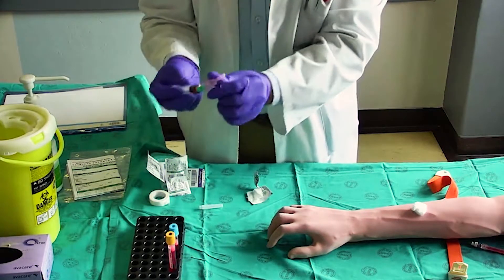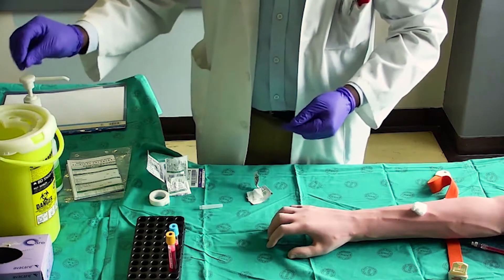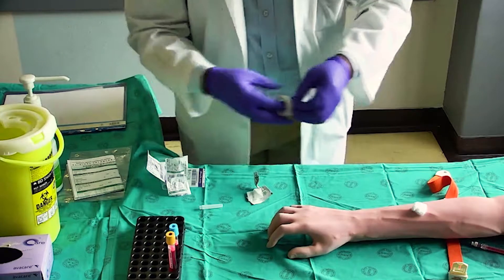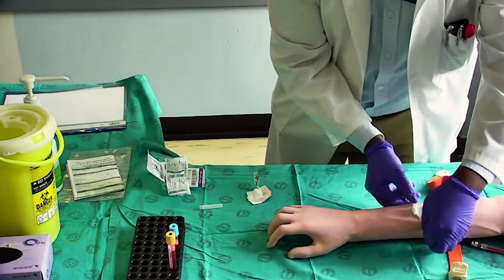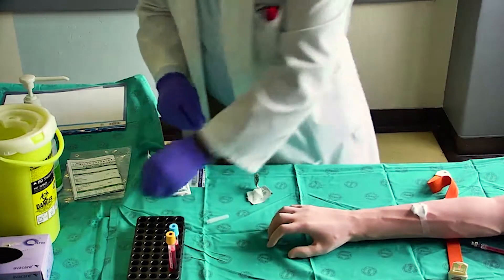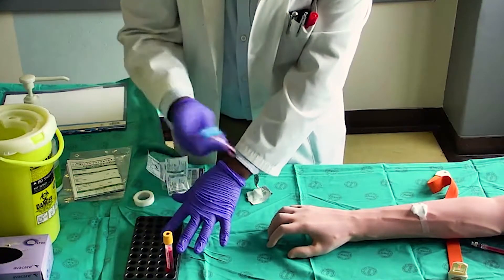The safety needle must be engaged immediately and discarded with the syringe into the sharps container. Secure the cotton wool ball with tape.